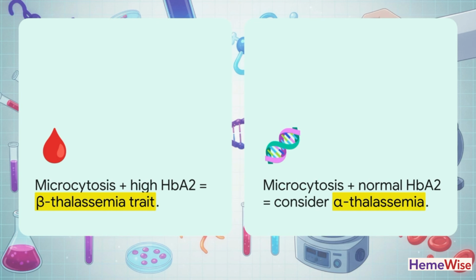They have microcytosis, normal iron, and a completely normal HPLC output. A novice might just write down no hemoglobinopathy and call it a day, but we now know that a completely normal adult hemoglobin separation right alongside microcytosis is the hallmark, flashing neon sign signature of alpha-thalassemia trait.